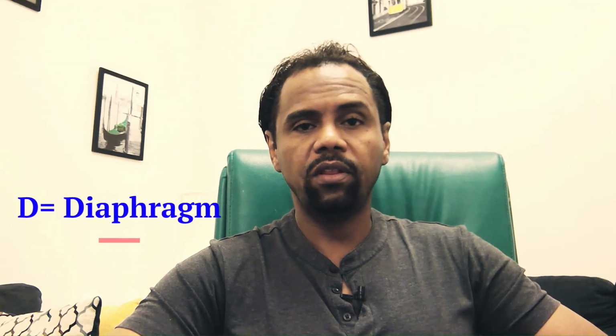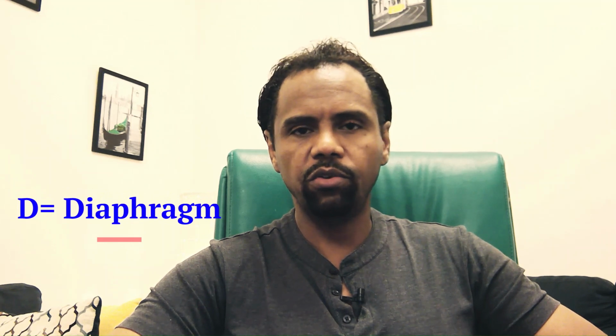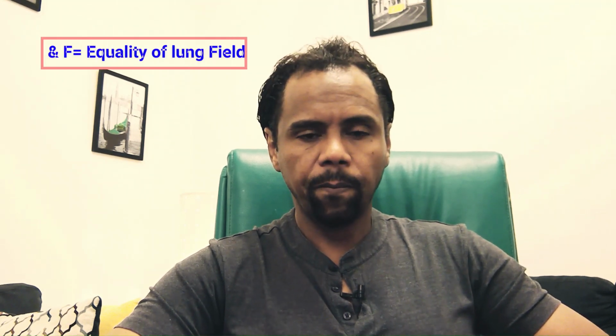Then D, you are going to check the diaphragm, because the diaphragm should be apparent in the X-ray as the costophrenic angles. You are going to go to E and F. Both of them point to the equality of the lung fields in the X-ray.